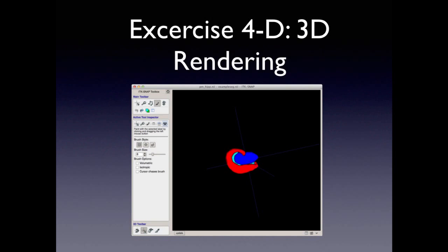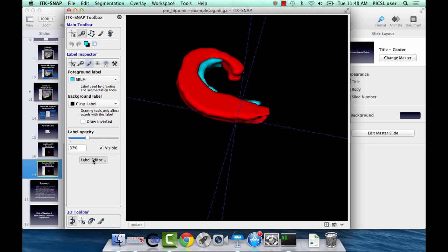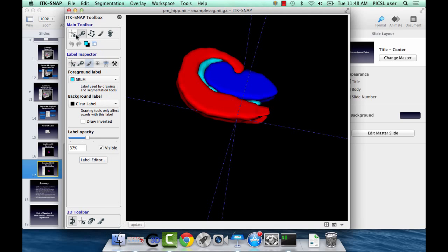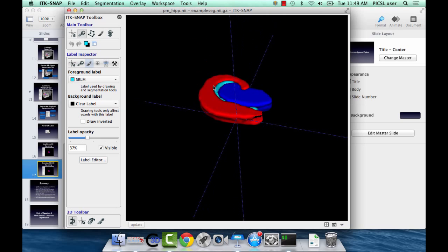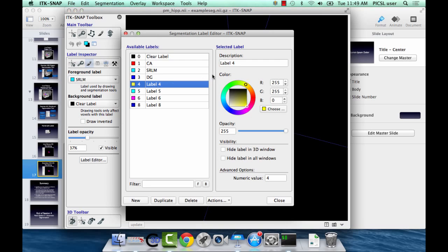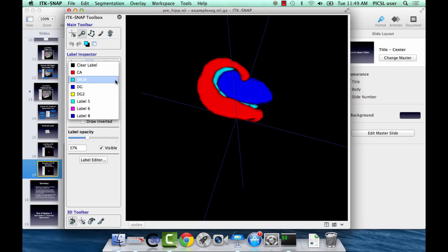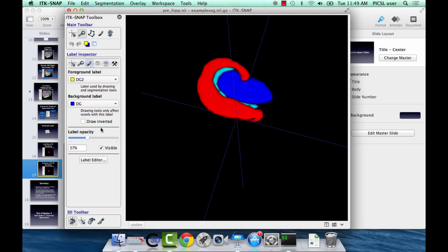So let's go on to the last exercise, 3D rendering. This one's pretty straightforward. So, I don't ever actually use the spray paint tool, but it's just a way to relabel voxels. The scalpel tool is pretty useful, though. The scalpel tool is used, this one right here, for when you want to relabel large areas. So, for instance, let's say when I did dentate, I used the wrong label by accident. I labeled the whole thing with the wrong label, and I want to change that. So, I actually wanted to make it label 4. Let's say that's dentate 2. So, what I could do here, I could select dentate 2 as my foreground, dentate as my background. So, I want to relabel dentate as label 4 as dentate 2.